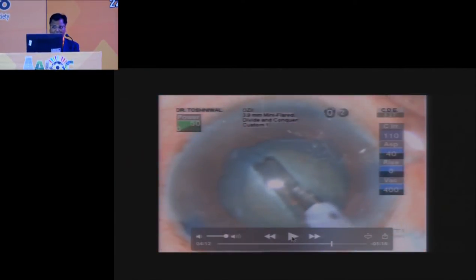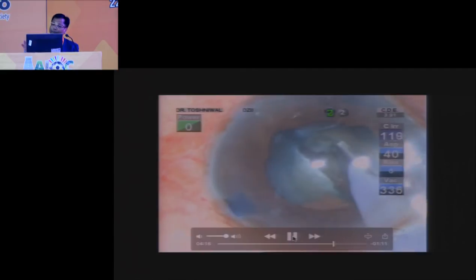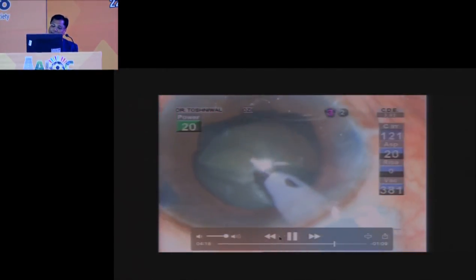Now here the point is that you have to use a chopper, and when you use more instrumentation, your AC can get shallower still. That is very important when you are doing a hard cataract. But here we can do the same way, lift this piece at the level of the capsulorhexis border and try to go to the edge.